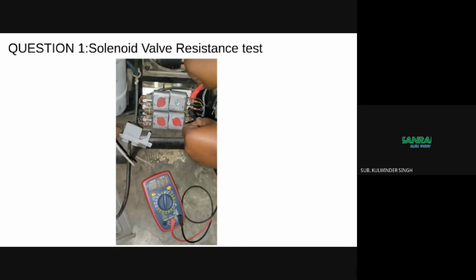You can refer to the service manual for the AirSep Intensity 8 for how the coil can be replaced. You can repeat the same procedure to check the integrity of the waste valves. Images of the solenoid valves for testing and checking the coil are being enlarged, so that you can see in the image. Thank you.